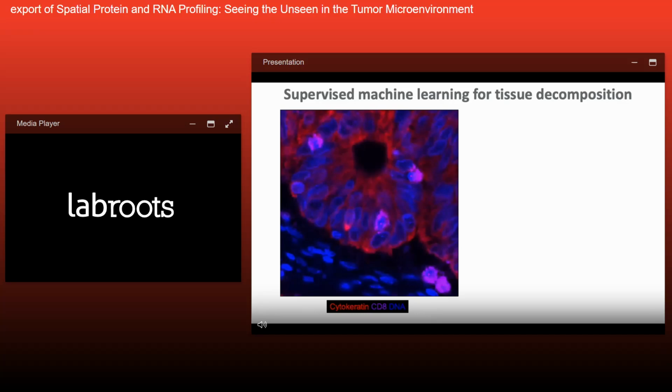As you can see, there's probably about 5 different cells that we would consider T cells here. Some of those are within intraepithelial areas or surrounded by tumor cells, and there are a couple T cells in the stroma as well. And if we decided to just write a rule that explicitly said identify T cells, you might look for circumferential expression of CD8. And as you can see here, really none of these cells actually have a circumferential CD8 expression pattern in the membrane, but they are all cells that we would probably want to recognize as T cells.